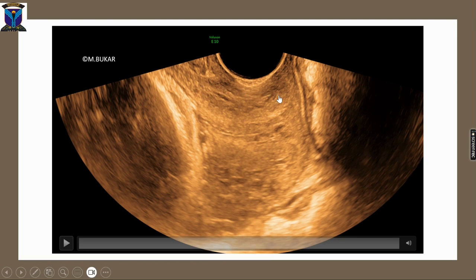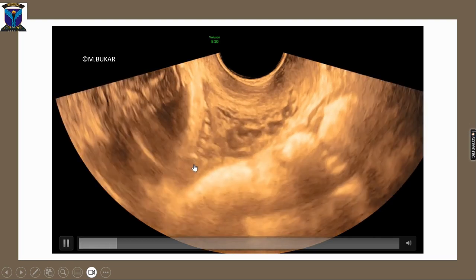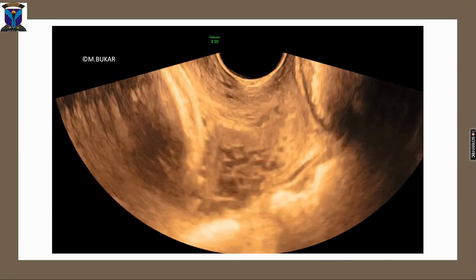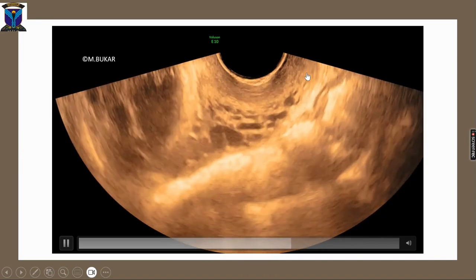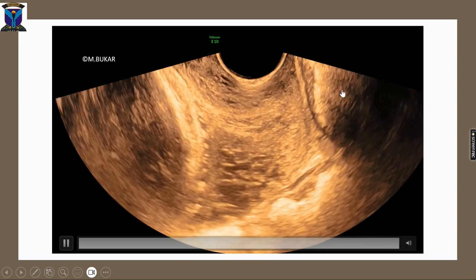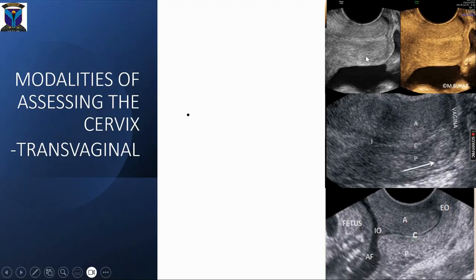This is a transvaginal image. Look at the quality — you can clearly see the anterior lip, posterior lip, vagina, external os, internal os, cervical canal, and cervical mucosa. Here is the presenting part. This video also demonstrates the cervical sliding sign, which is not present in this case. These additional transvaginal images clearly outline the anterior wall, posterior wall, external os, internal os, cervical mucosa, vagina, posterior fornix.